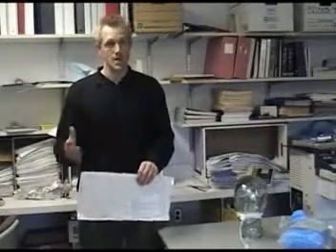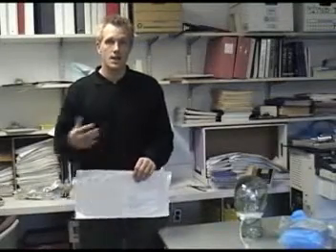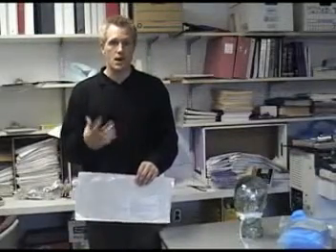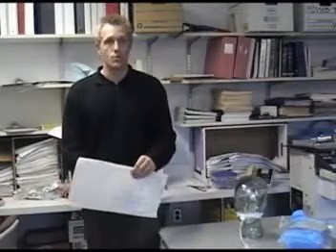Secondarily, and just as important from a cost perspective, is by doing BALs, you can also eliminate a lot of false positives because the upper airway contamination of tracheal aspirates often yields a bunch of different bugs that aren't necessarily the causative organism down in the lower lung. Therefore, what you can do is rule out VAP with using BALs. A lot of times what people are doing now is bronchoscopically guided.